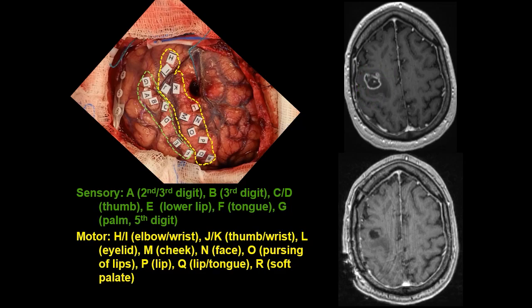One can see the high spatial fidelity of the expected somatotopic distribution of function in these regions, as described in the text below.